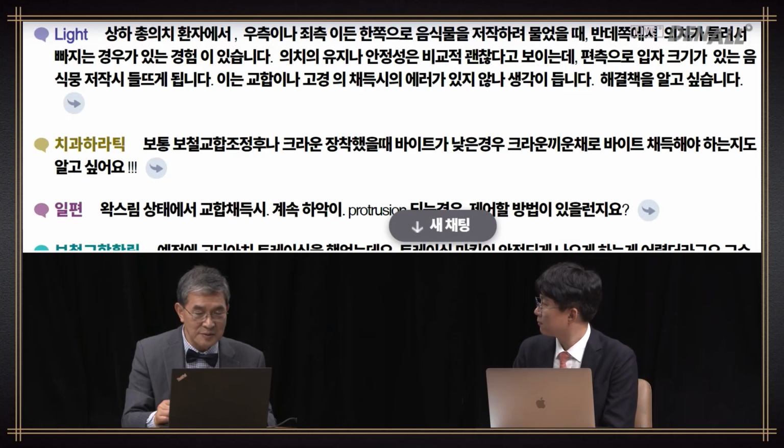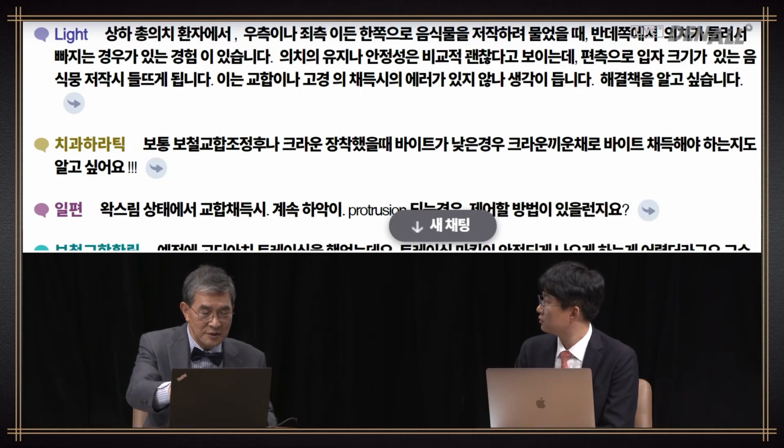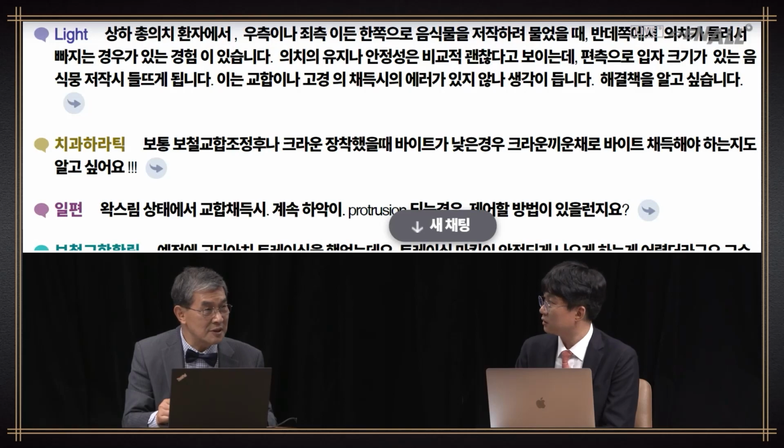So based on the proper retention and stability, impressions were taken properly. After that, occlusion should be checked, and then post-sealing should be checked as well.